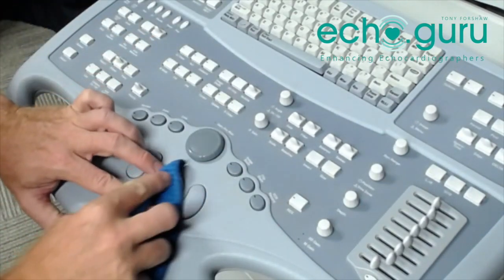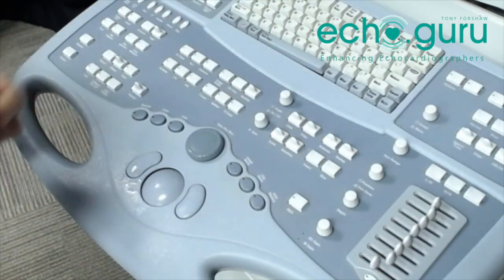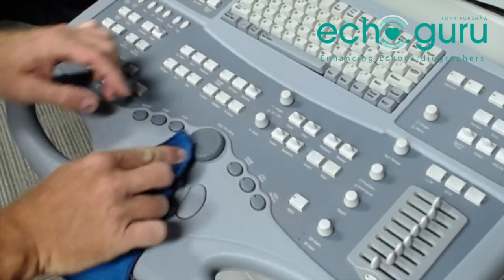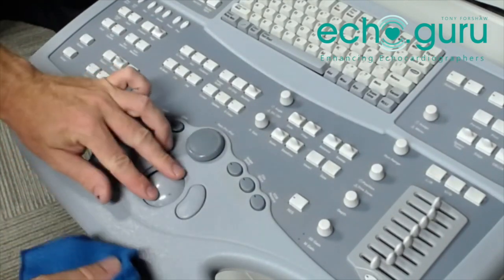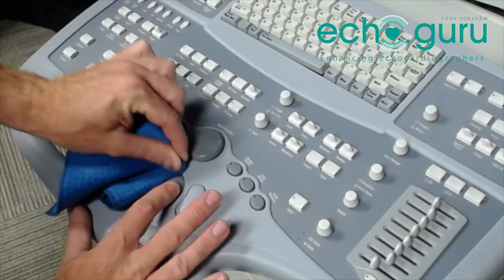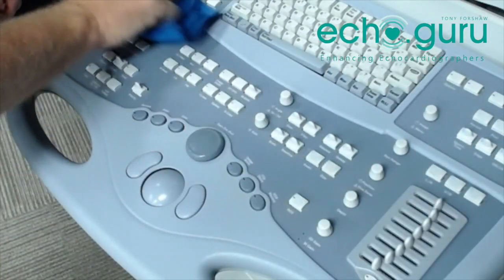I clean my trackball once a week — try to make that part of the end-of-week process. Clean the filters on the same day, so filters, trackball, and overall machine cleaning all happen once a week, usually on a Friday for me. The gel holder I do more regularly, same as cleaning the overall console — that should happen a lot more regularly. You can already feel a big improvement in how well the ball is moving; it's not sticking at all whereas it was when we started. If we look after our machines, they'll look after us, and I think this is a really important part of the quality process — just that general maintenance.